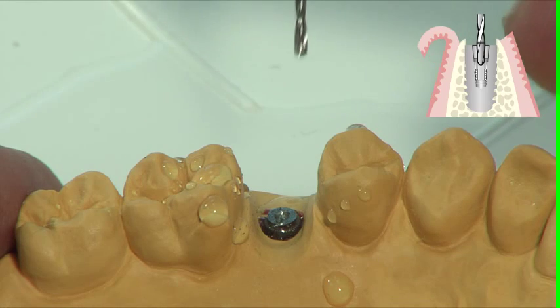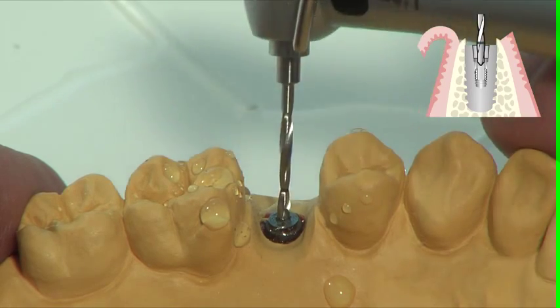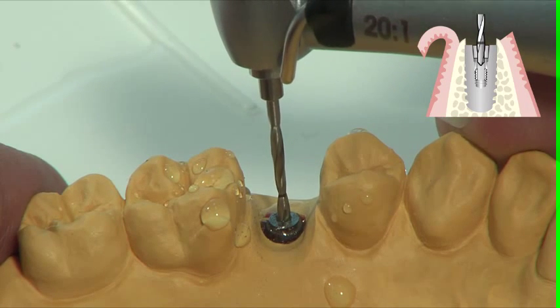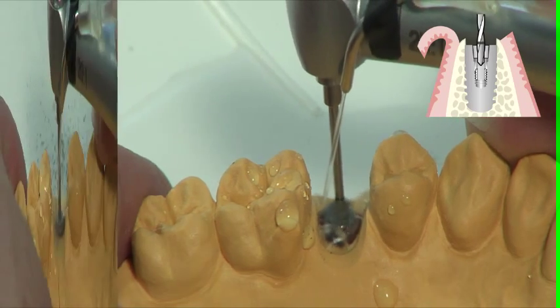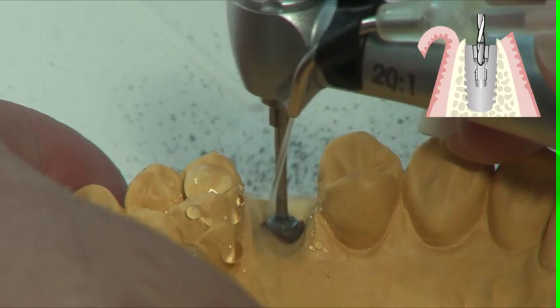Using the thread core drill M1.6, drill to a depth of 3 mm up to the marking. Align the drill according to the implant axis and drill at a speed of 1,800 rpm with good irrigation. Apply sufficient pressure with the drill in order to observe clear chip formation.